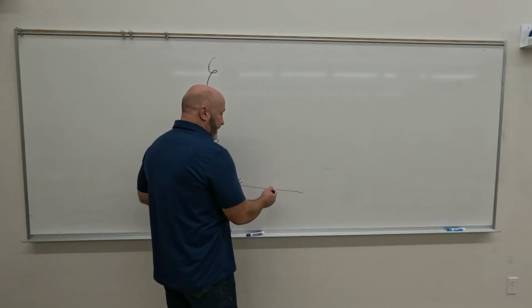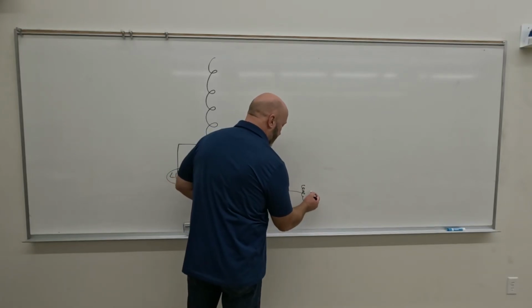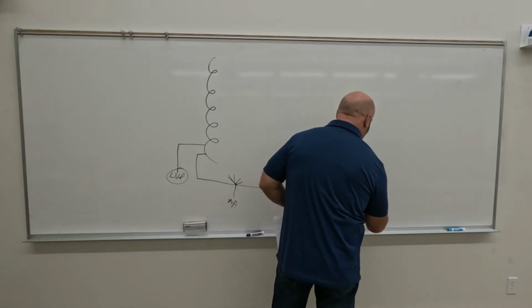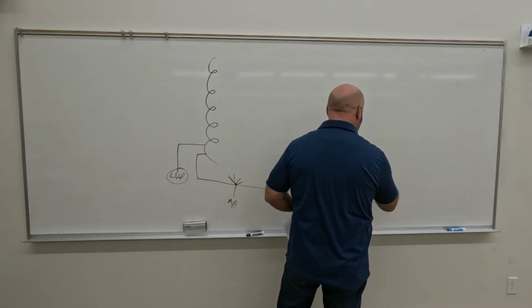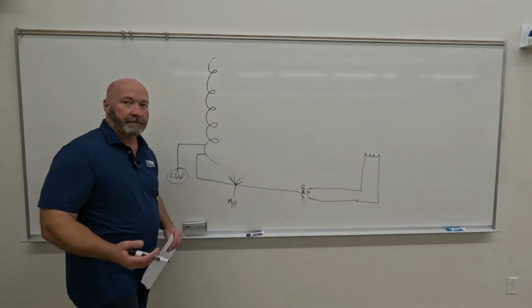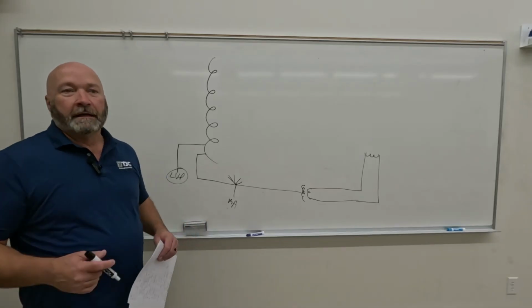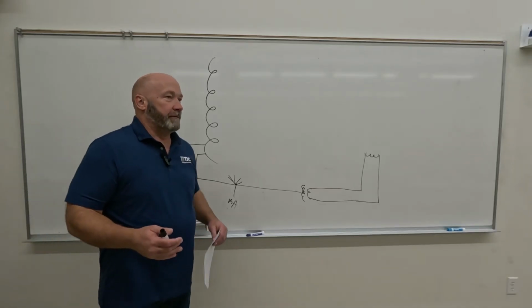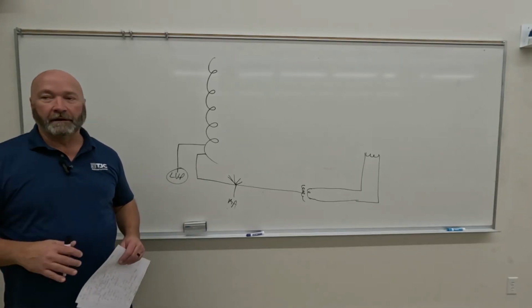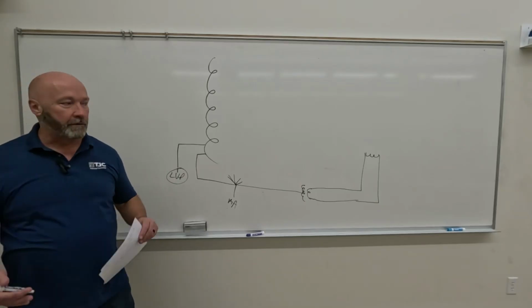So we select our mA and then we send it through a step-down transformer, and then that comes out and goes into the filament. The whole purpose for this circuit was thermionic emission, to heat up the filament. Thermionic emission works off of anywhere from 12 to 25 volts, and anywhere from 3 to 6 amps. So relatively high amperage, very low voltage, so that we don't send electrons across the tube before we're ready for them to go across the tube.